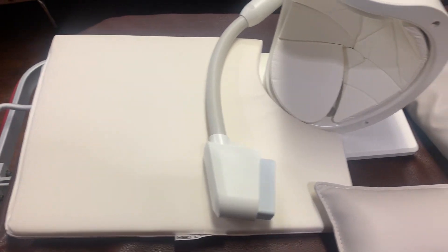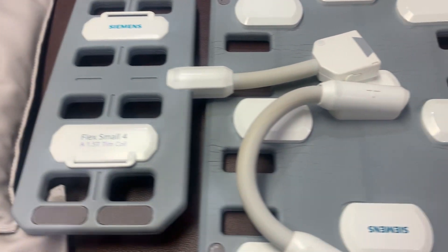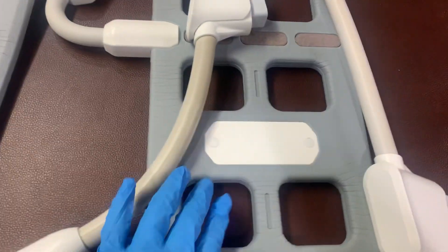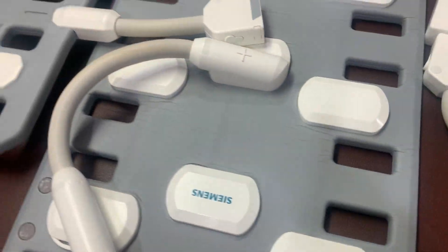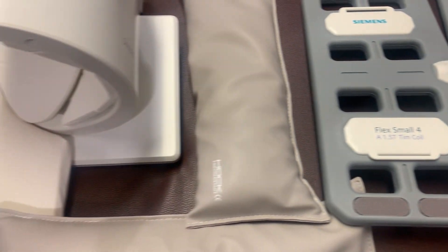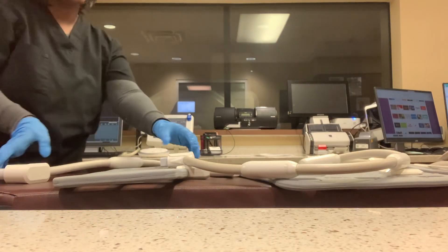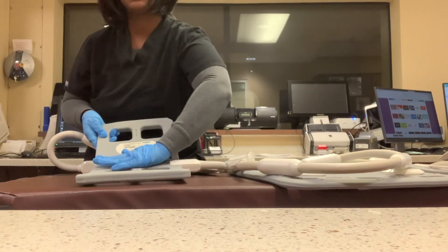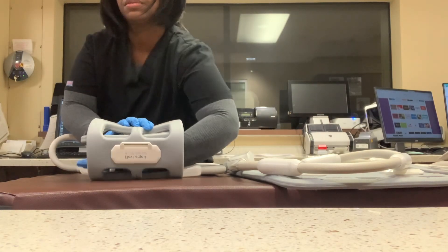Now we have the shoulder coil. This is set up for a left shoulder — you have your sandbags, your flex coil, your body coil, and then you have another flex coil. You can use the flex coil for your extremities and it can just flex. You can use coban or tape to tie it together, or a strap.